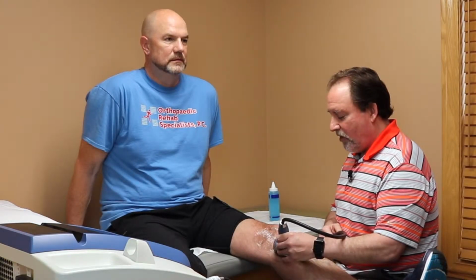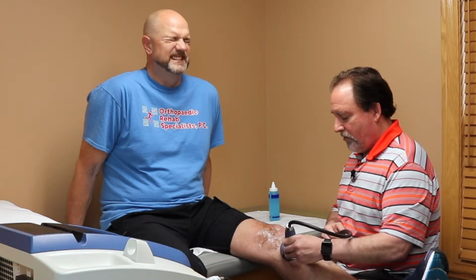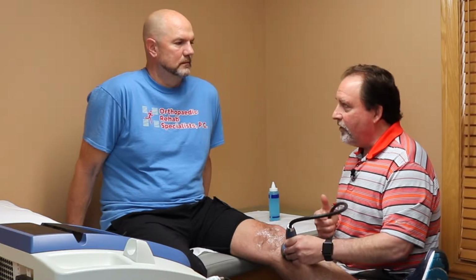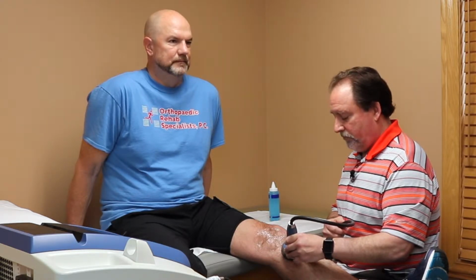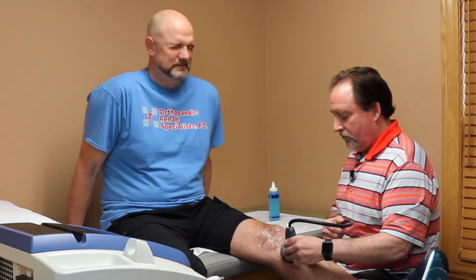Okay, we're at about 500 pulses, so let's find another spot. It could maybe be very close. If you went a little lower than that, and just to the right of that, maybe. There you go. That's another thing. After a few times, the patient themselves can direct you. Just a little bit down, just a little bit up. Intensity's good. Still on it. Yeah, right there for a bit. Go to the right, maybe. Right there. That's a good one.